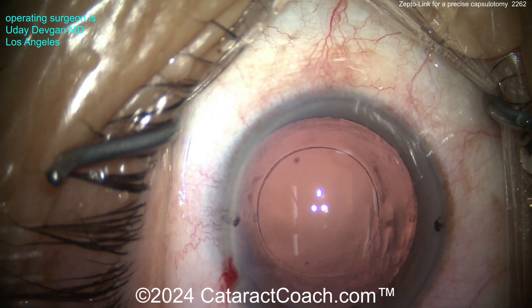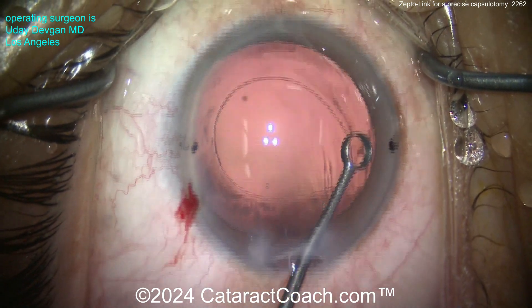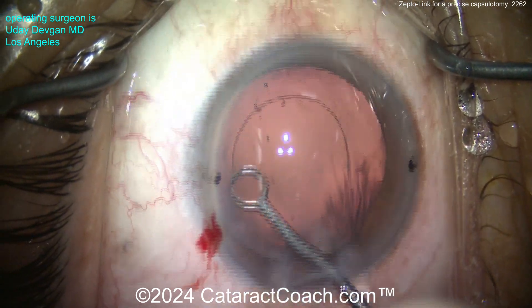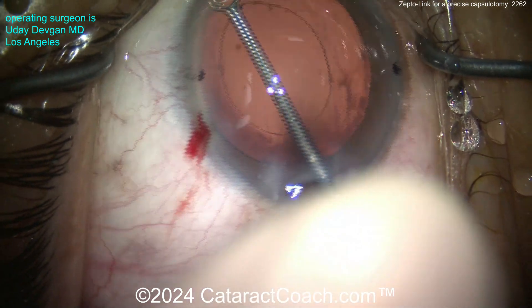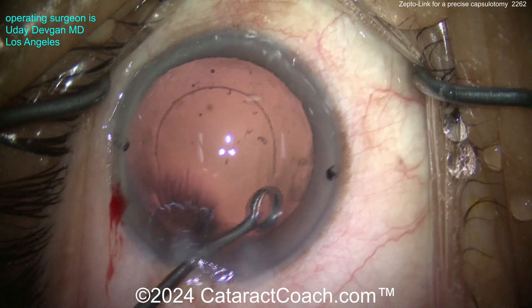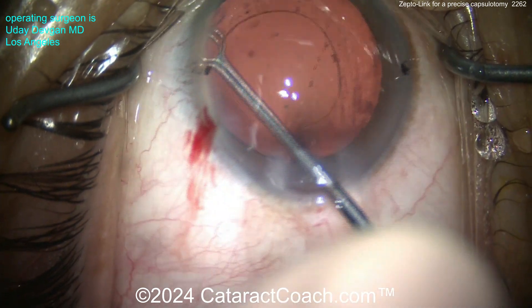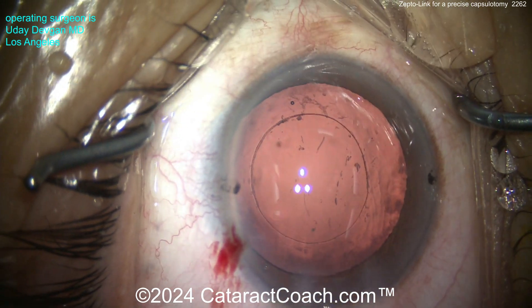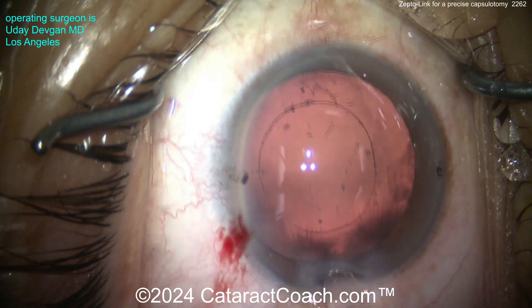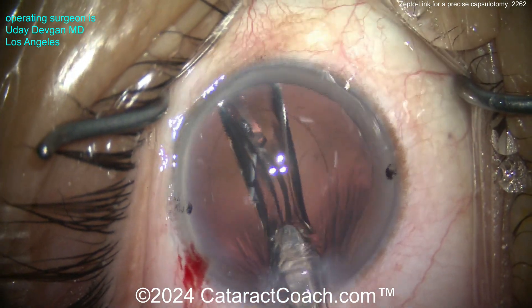I do work with Centricity Vision — I have a financial disclosure: I am a consultant for their company. But I think if you try this device you'll become a fan too. In our surgery center this costs less than half as much per case as a femtosecond laser, and it creates a capsulotomy that's at least as accurate if not better, and certainly stronger than a femtosecond laser. I really think there's no downside.